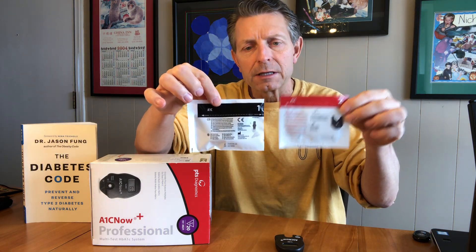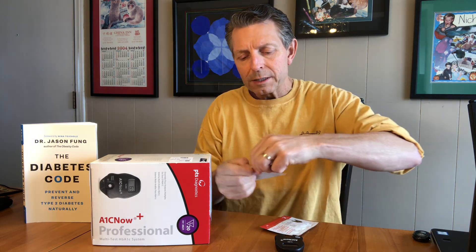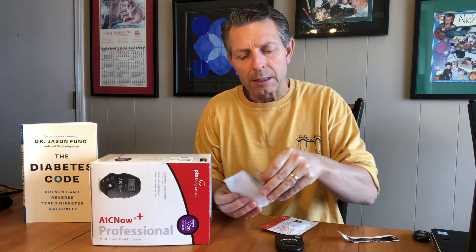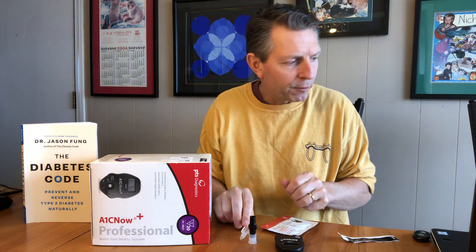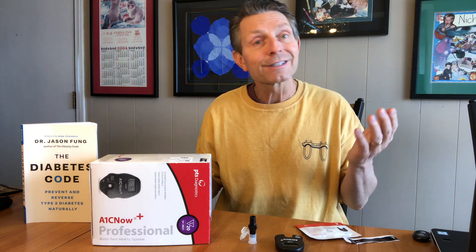We have two packages — two test components. One test component is a blood sampling device. This is a small piece we're going to use to collect the blood after we poke our finger. And then we have a reader card that goes into the card reader. So really this is how it works — it's quite simple.